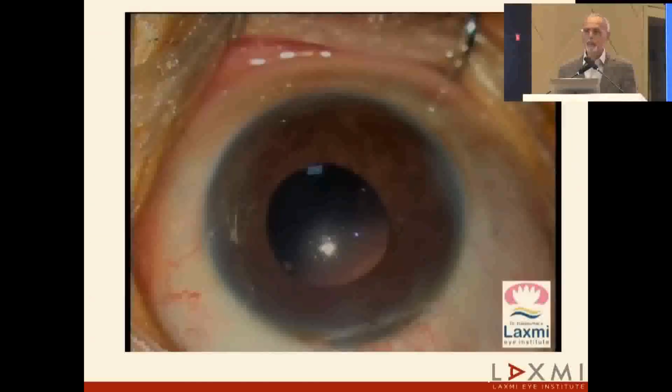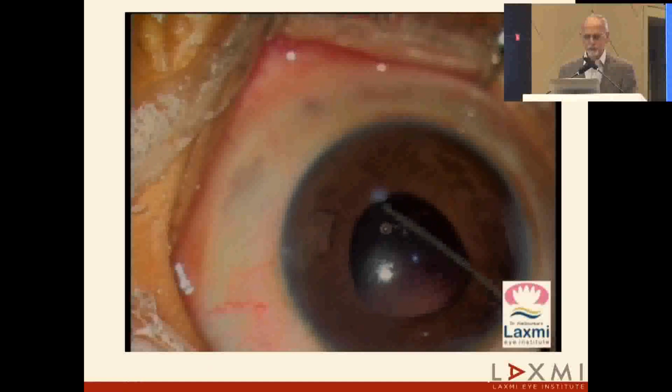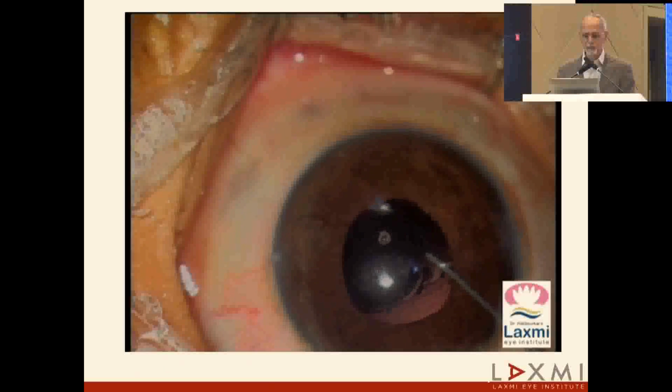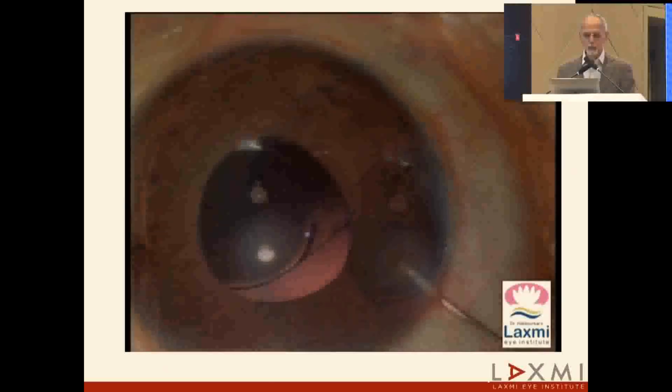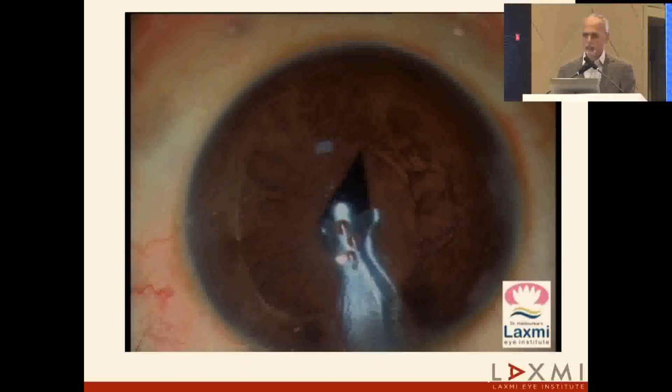But when you do that, you should also know how a disenclavation is done, because quite often, not in a very large percentage, a patient may present with a hanging lens primarily because in the initial period it was not enclaved properly. So you should also know how to manage this. First and foremost, if it's hanging on one enclavation, it is easy.